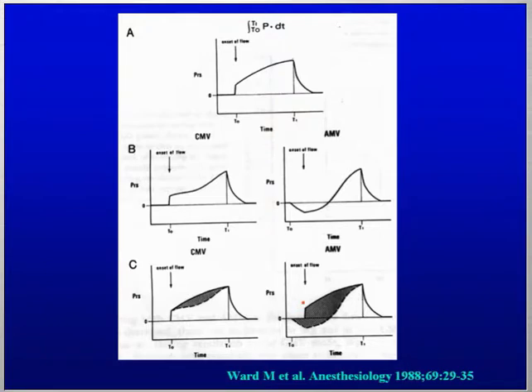And if you superimpose the two curves, you see that this difference is related to the work, the effort done by the patient. Interestingly, when they made recordings in patients, this occurred also in patients who were supposed to be under controlled mechanical ventilation with no supposed effort to trigger the ventilator. In fact, the patients were doing efforts.